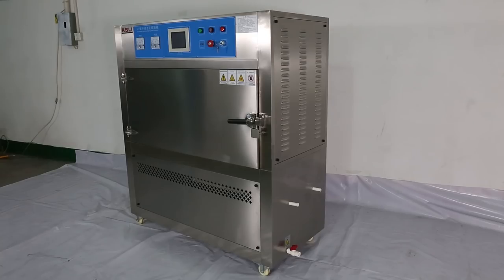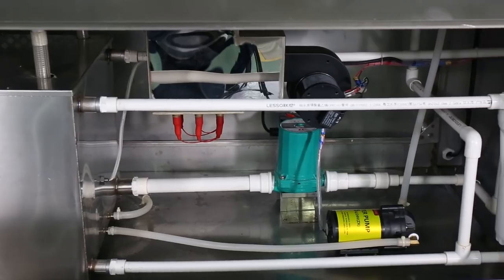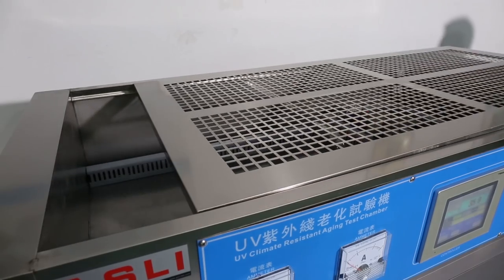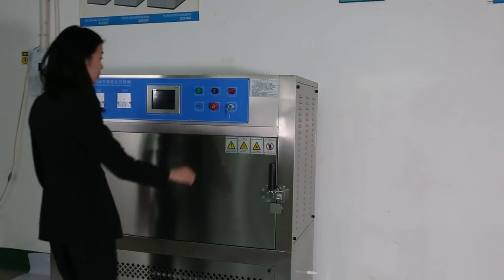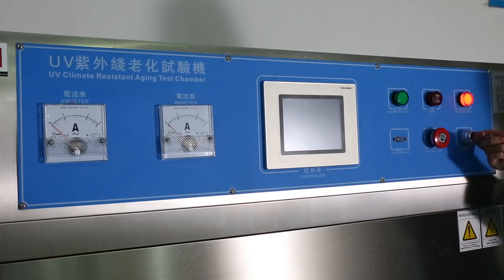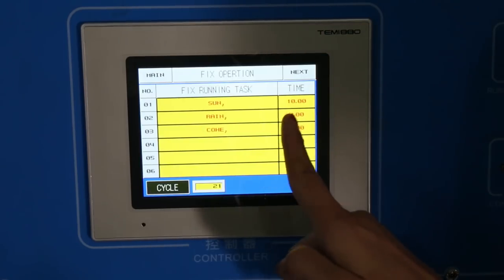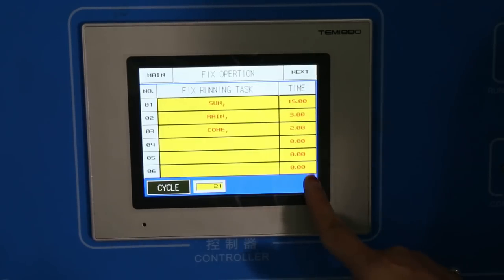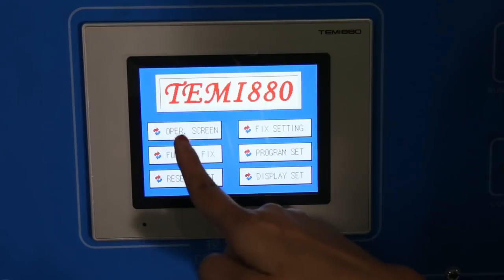UV Chamber provides climatic simulation such as sunlight, rain, and dew to check the sample damages that occur over months or years outdoors. For sunlight simulation, we have UVA, UVB, and UVC with different wavelengths according to customer requirements.